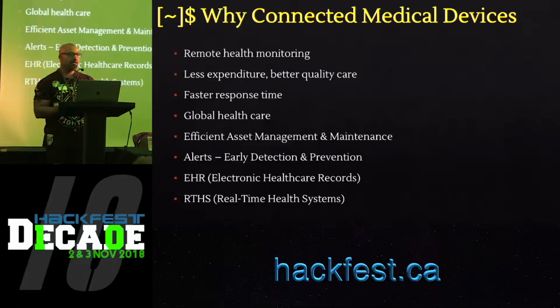And then there is something called a code. The code tells you if that particular user is a patient, a manufacturer, an administrator, a doctor, or a pharmacist. So you can take these logins and log onto the portal as different users and gain access to even more medical records.